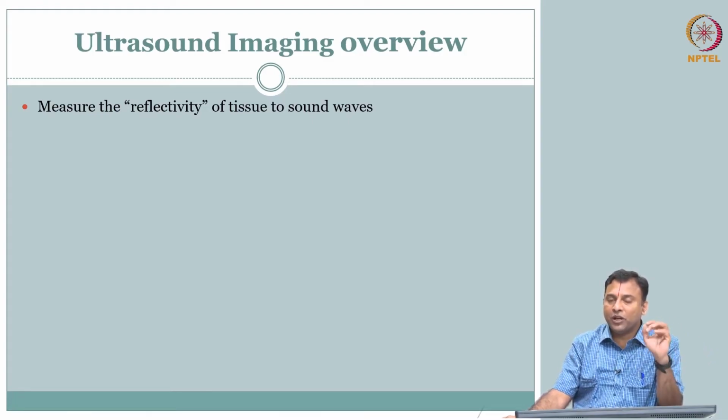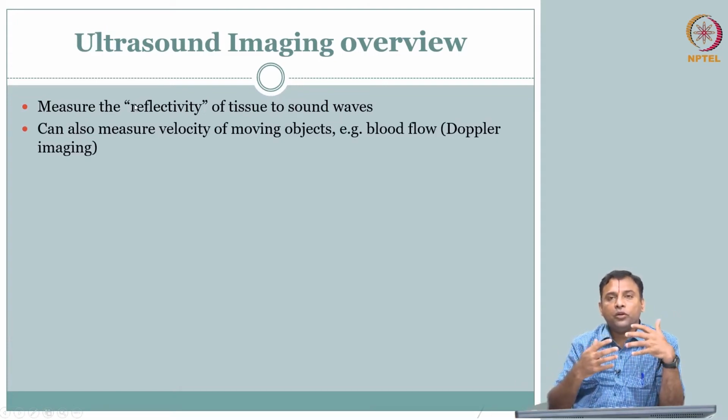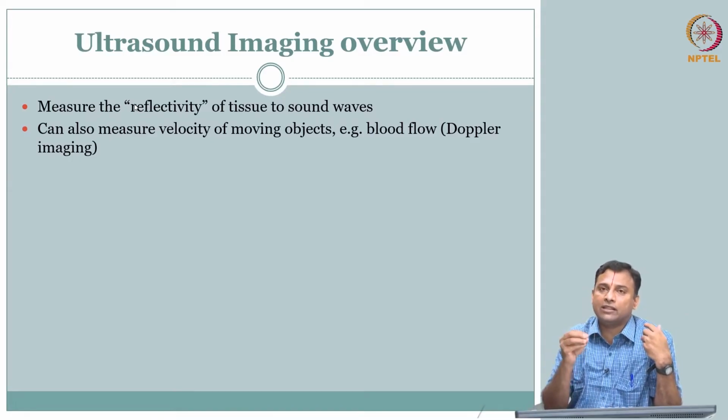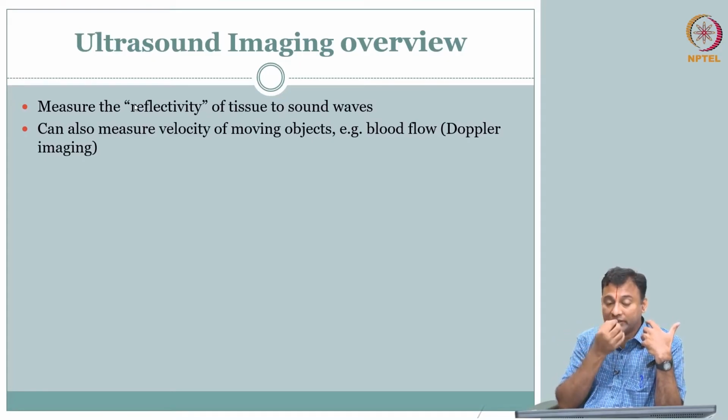So, this is newer information about the material, the object, okay. Apart from this, we talked about the distribution of mu in X-ray, structural imaging, and when it came to PET we were talking about nuclear activity, and essentially there also where the radioactivity is coming from was interpreted in relation to some physiology that is taking place.